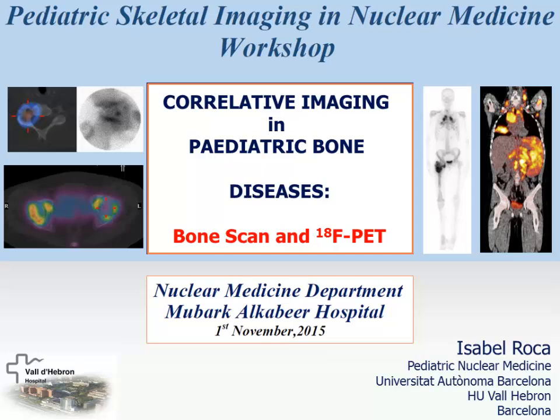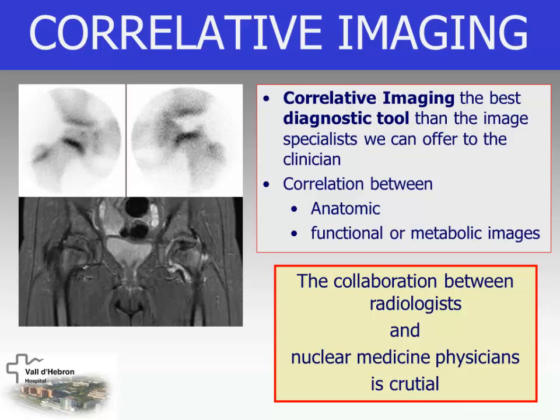The title of this lecture is Correlative Imaging in Pediatric Bone Diseases, Bone Scan and PET with fluorine. In fact, as we have seen this morning, correlative imaging is the best diagnostic tool that the imaging specialist can offer to the clinician, with the correlation between anatomy and function or metabolism. And the collaboration between the radiologist and us is crucial for this.